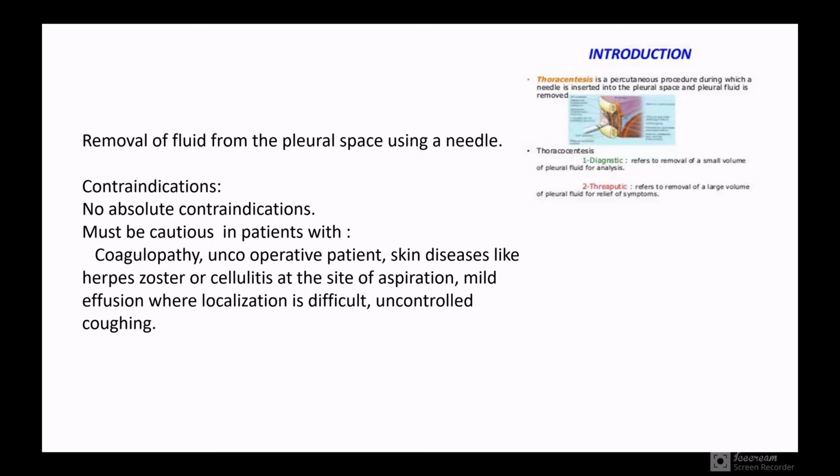Thoracocentesis is done for two purposes, diagnostic and therapeutic. For diagnosis, you remove a small volume of pleural fluid for analysis, and for therapeutic, removal of a large volume of pleural fluid to give relief to the patient.